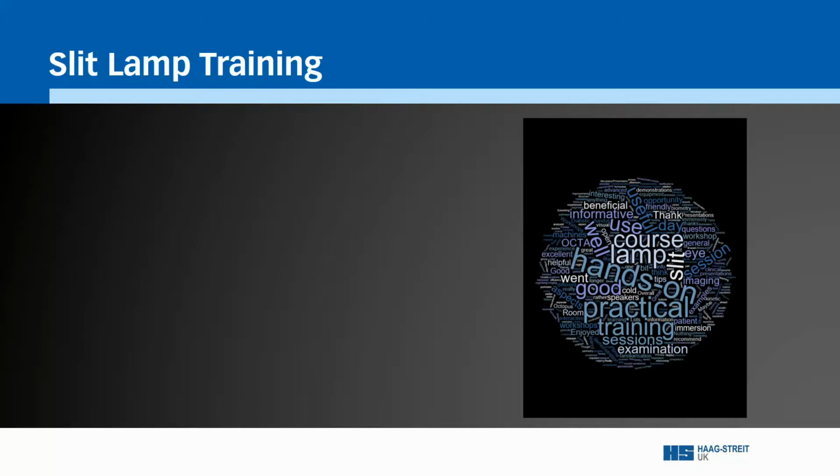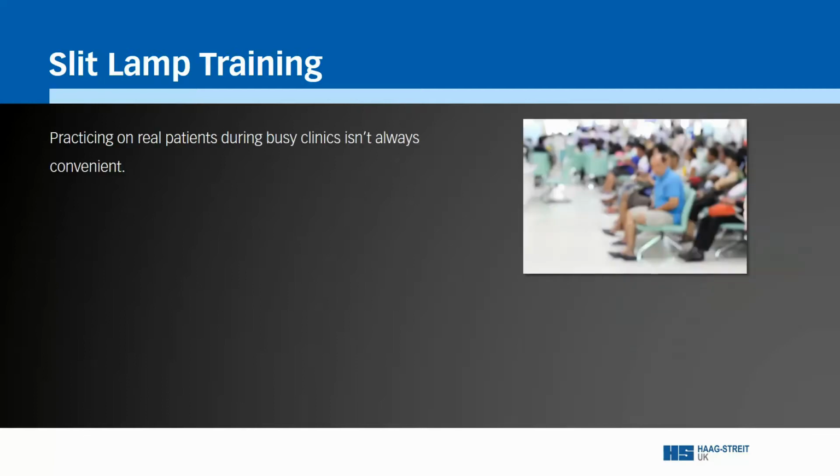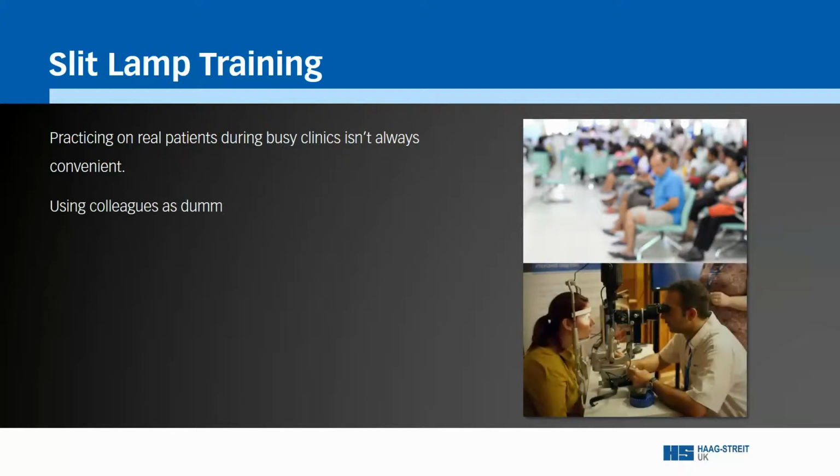But hands-on practice isn't always possible. Time is limited during busy clinics, and it's not always convenient to learn on real patients, and during a pandemic, I'm guessing it's now impossible.